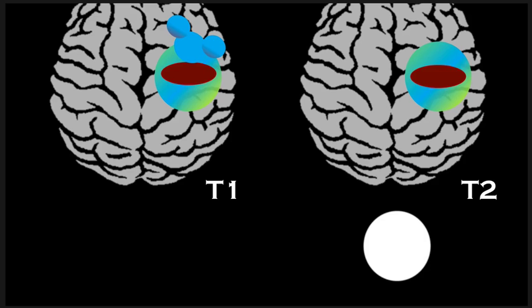And then we've still got the functioning methemoglobin molecule. It's just extracellular. Remember I said that that thing sort of diffuses around. So the water effect is going to stay the same, so it's still T1 bright.